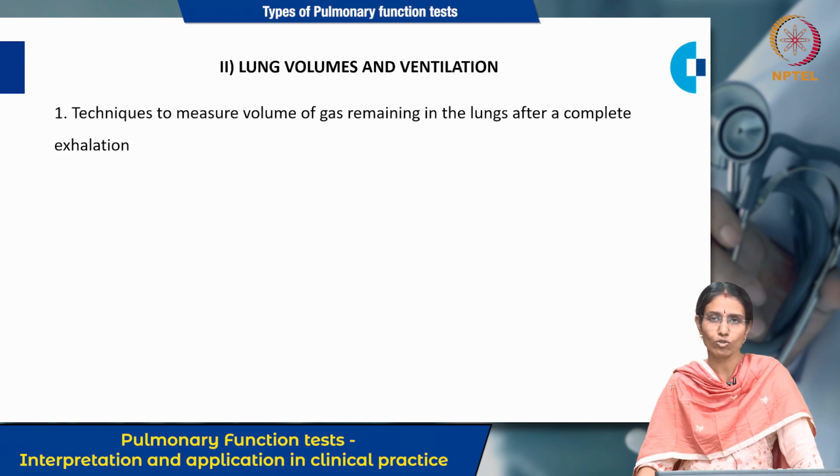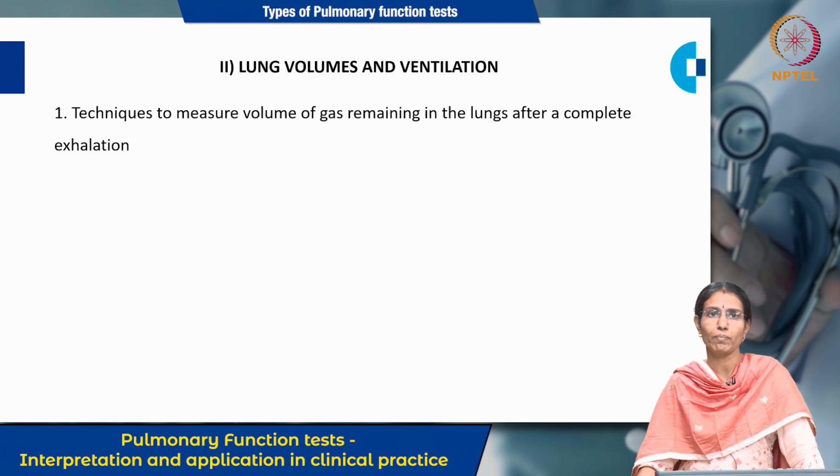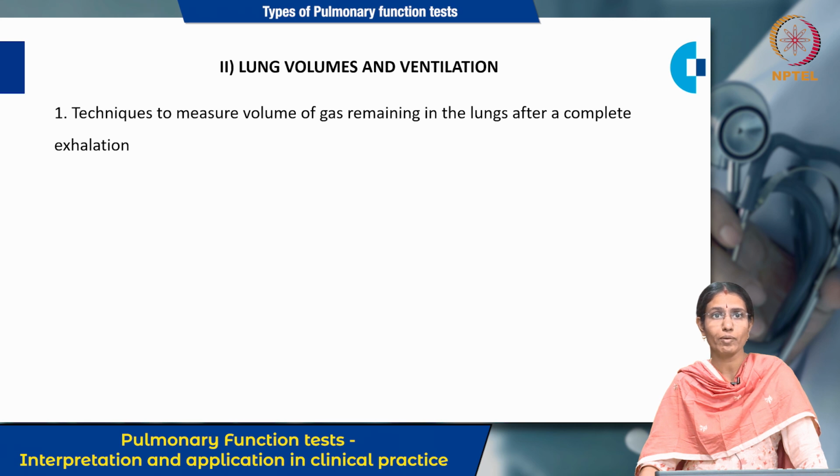So, there are techniques to measure the amount of gas which remains in the lungs after a complete exhalation. You will be seeing in module 5 that a lot of lung volumes can be measured using spirometry technique, but certain lung volumes, like the amount of air which remains in the lungs at the end of a normal exhalation, cannot be measured using that technique. You need special techniques to measure those.